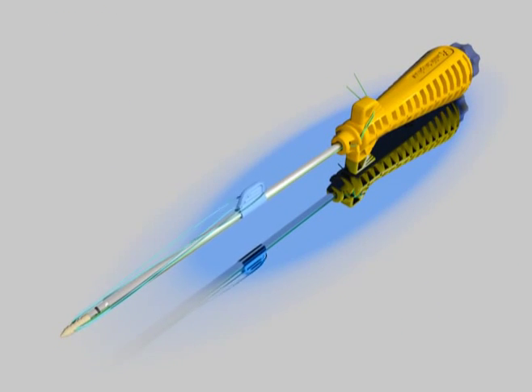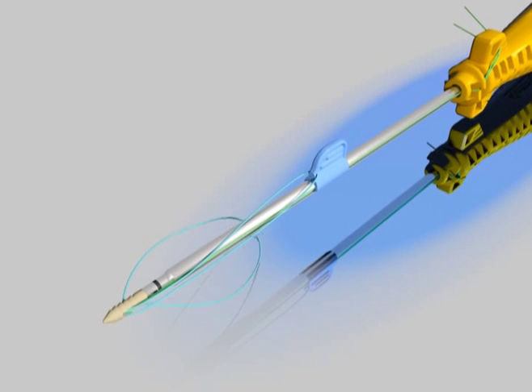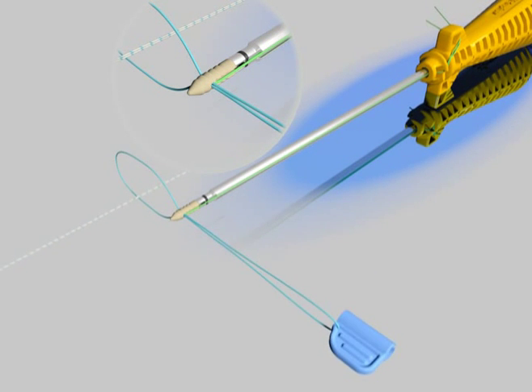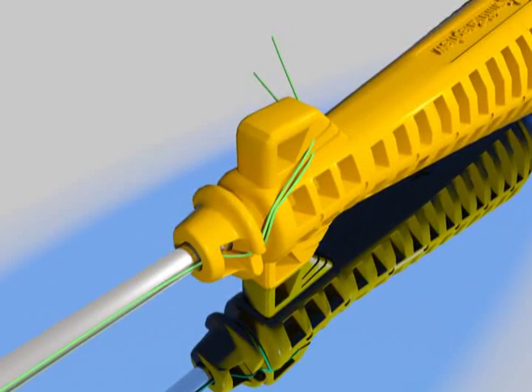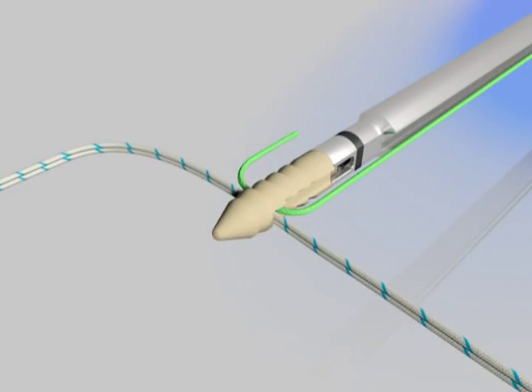The technique begins with passing a strand of ultra-braid suture through or around the labrum. The drill guide is then introduced, and a hole is drilled on the rim of the acetabulum. Both suture limbs are then passed through the threader loop and brought through the suture eyelet. The anchor is tapped in, and the retention suture is removed.